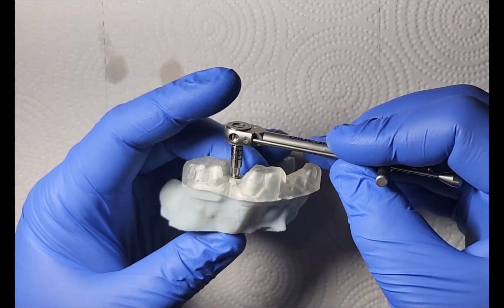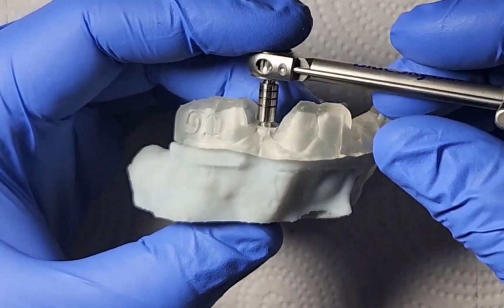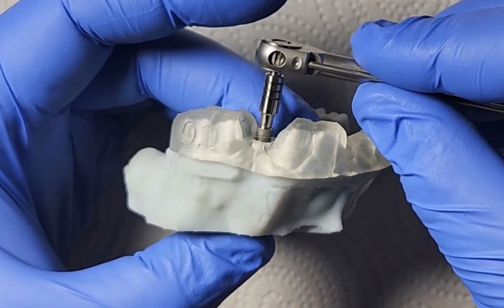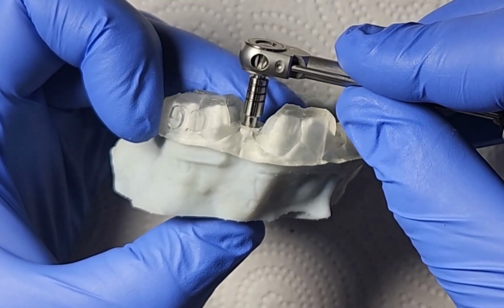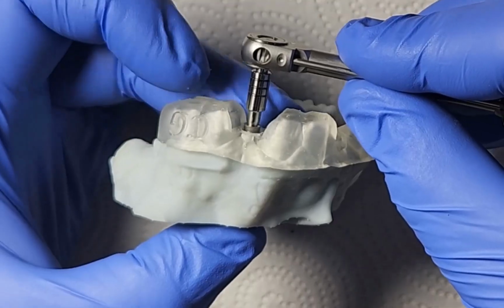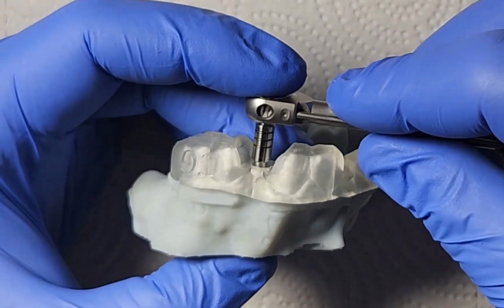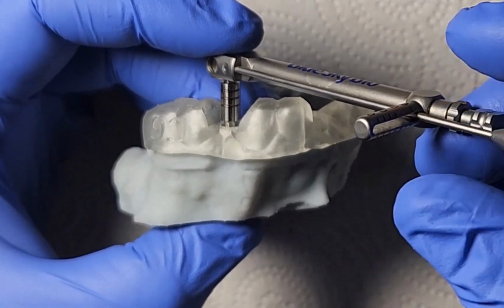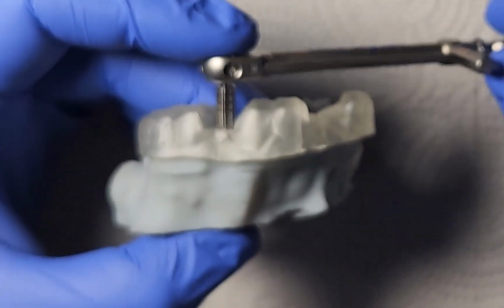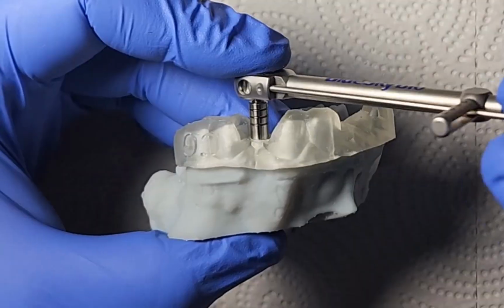And so here I've got a 4.3 by 10 implant, and I've got this on the variable height driver. And so again, you're going to go into the osteotomy through the guide, and with the variable height driver, the very first line that you'll come to, that's the standard 8.5mm offset. Okay, so I need to change my direction here so I can begin cranking this in. So that's the standard 8.5 offset.